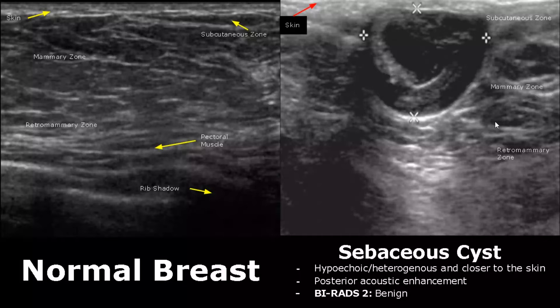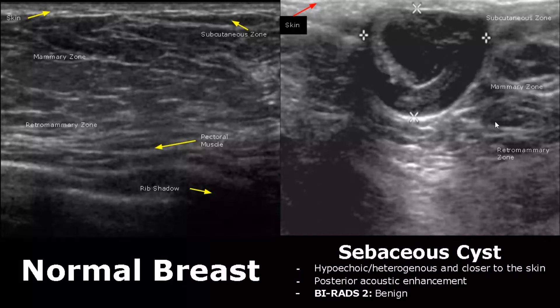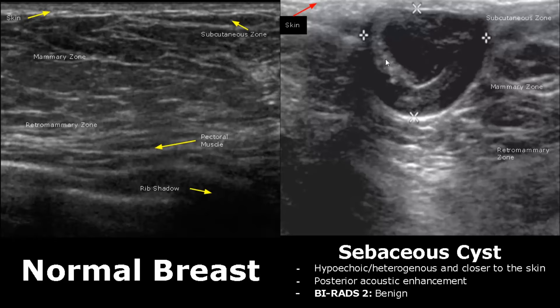A sebaceous cyst is a complex cyst present closer to the skin. You can see it is present just below the skin and even involves the skin, so this superficial location can help in diagnosing a sebaceous cyst. It is classified as BI-RADS 2.